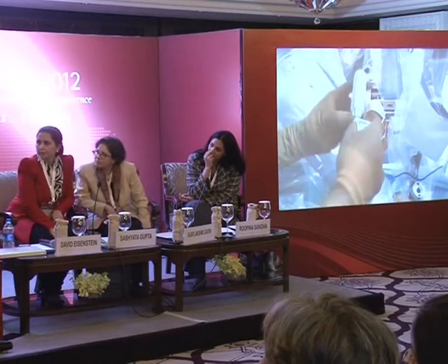Now you've got a rigid metal manipulator that's arced, with a colpotomizer on the end. It's got a pneumooccluder balloon right here, and then you can do your hysterectomy. So it's very simple to use. We used it on the first two hysterectomies today. In this particular case, we're just using it without the colpotomizer, since we just want to control the uterus. So that's what you see here. We're going to put this off the field because we don't need that.